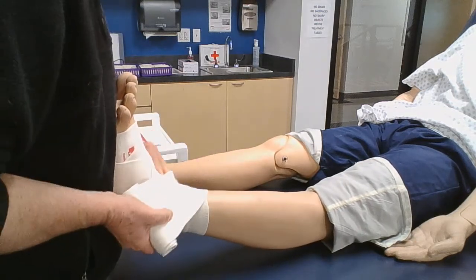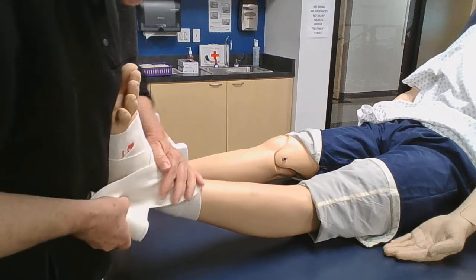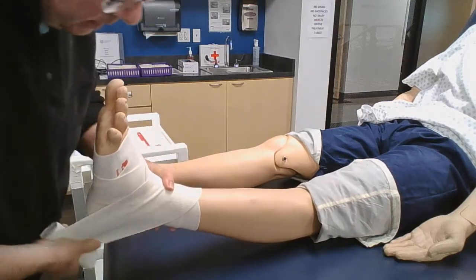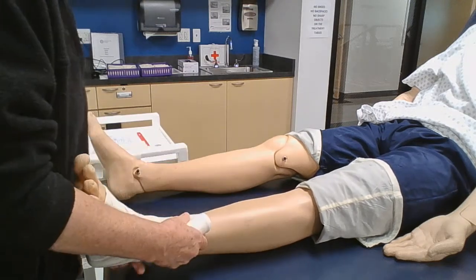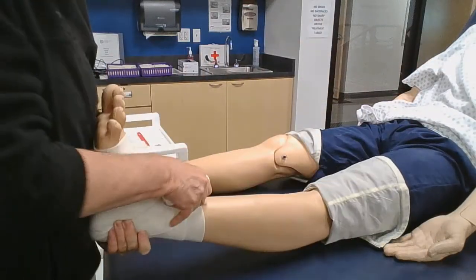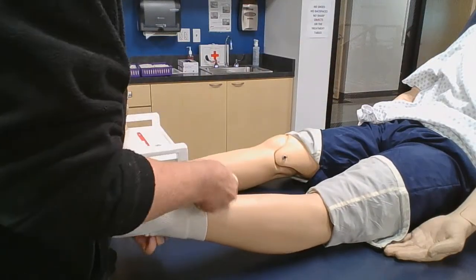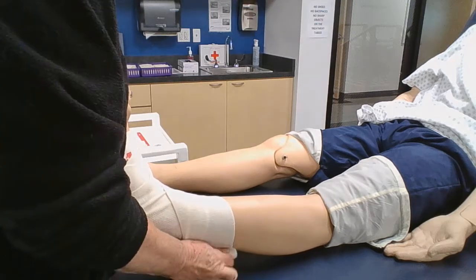Okay. And this is where I want to start my pattern, you guys, okay. I'm going to start my pattern right here. I'm going to go down again. I need to capture that heel. I'm going to make sure I captured the heel, guys. Okay, thank you, Joe, for that demonstration. All right, and now I'm going to start with my pattern, right?